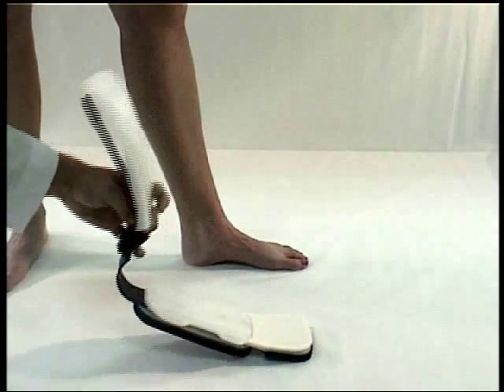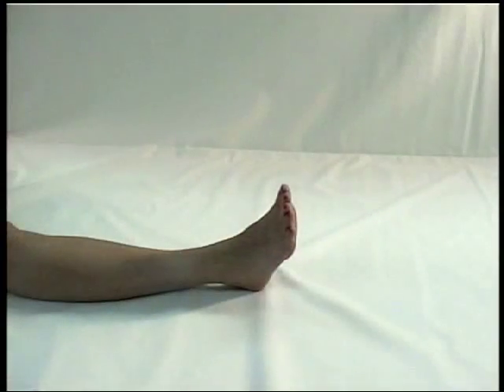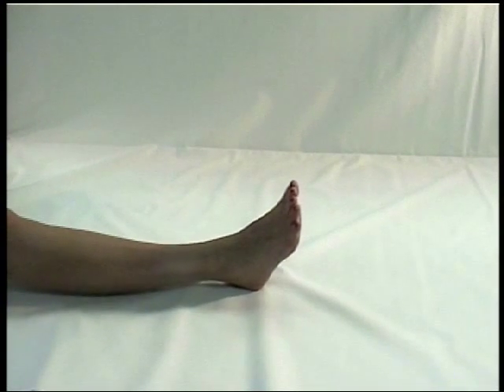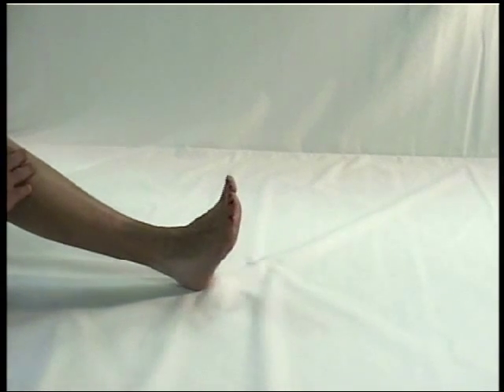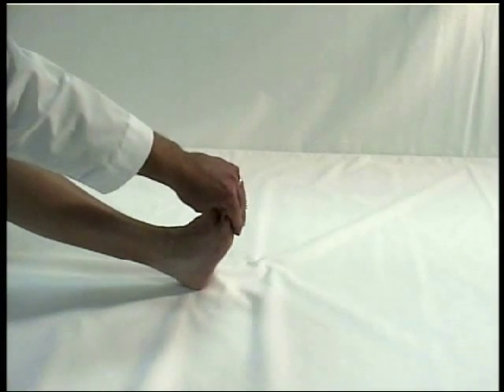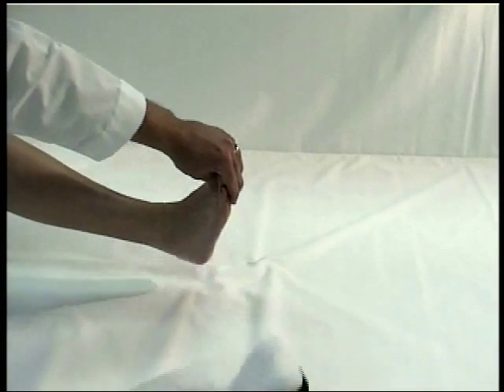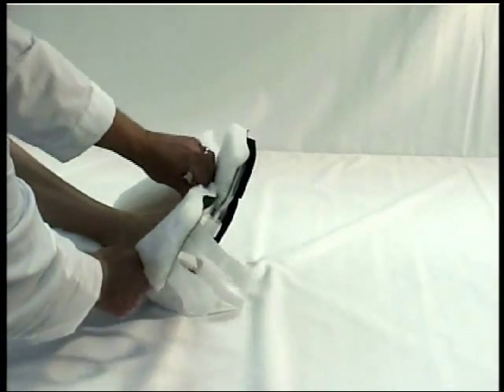With your patient either sitting or supine, proceed to fit the orthosis with the liner fully opened. Have your patient flex their knee to approximately 60 degrees and dorsiflex their foot to a neutral position if possible. Based on the patient's condition, you may have to assist by gently grasping the patient's toes and applying the orthosis against the foot and calf.